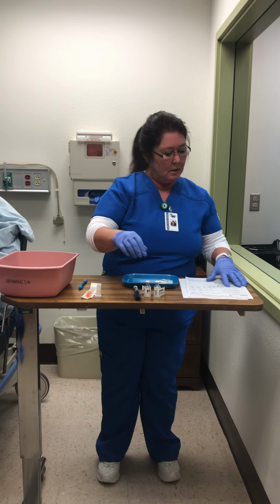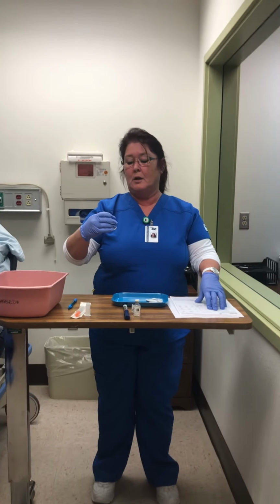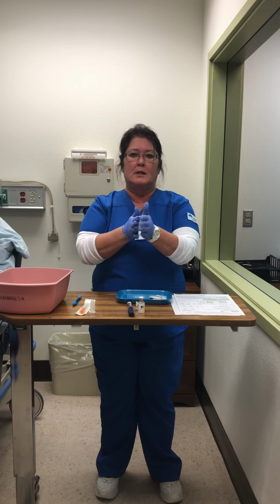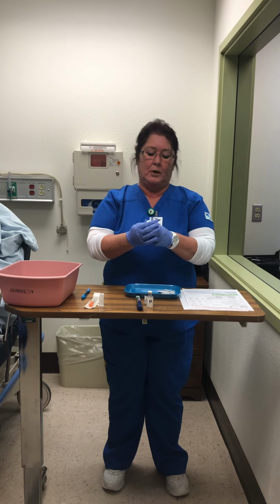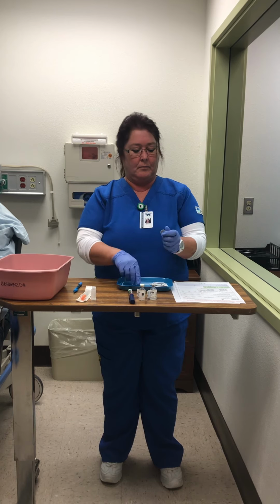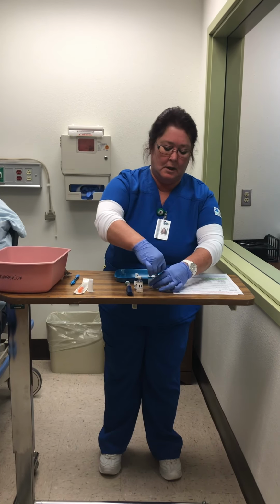So the first thing I'm going to do is we are going to get the NPH insulin U100 for Shirley Cost 514.64. I am going to roll this in between my hands because we want to make sure that it is mixed well. And I am going to pop the top, and I'm going to take an alcohol wipe and clean the top.